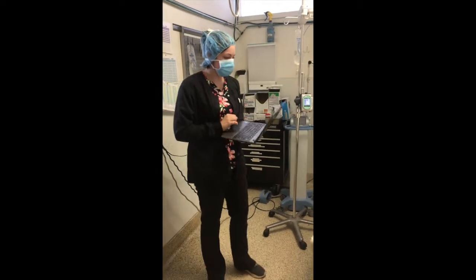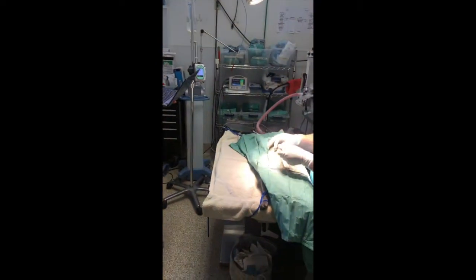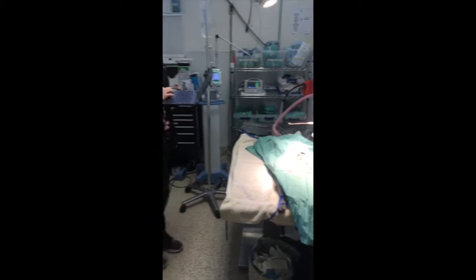Okay, this is Kinley. She's here for a canine spay today. I'm just going to go ahead and take some vital readings on her.